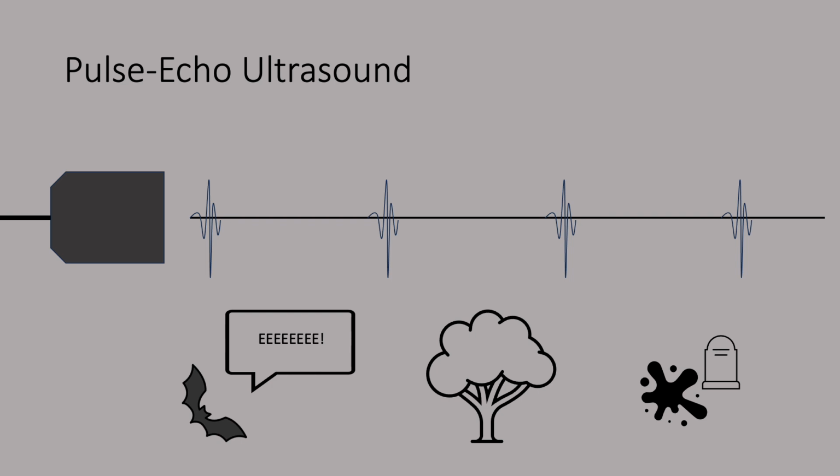With ultrasound, we have this pulse that's being emitted by the transducer and sent into the tissue, but the majority of the time, no sound is being emitted, and instead that same portion of the ultrasound probe is listening, waiting for those echoes to come back so that it can help us map and know exactly where we are in the tissue. Now, this kind of simplifies things because instead of just having one little transducer inside the probe, there's actually hundreds of them. And these are going off in a variety of different ways and different patterns to help us get the clearest images possible.